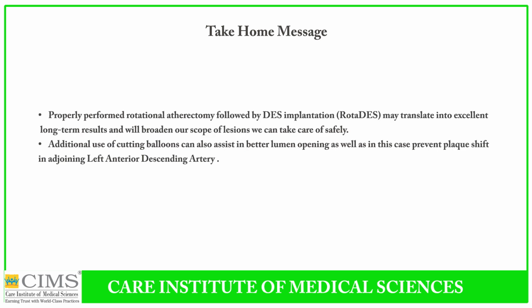So finally, a properly performed rotational atherectomy followed by DES implantation translates into excellent results, and latest data do confirm the feasibility of using rotablator or orbital atherectomy in such cases, and additional use of various cutting balloons, in this case the angiosculpt balloon, assisted in even much better opening.